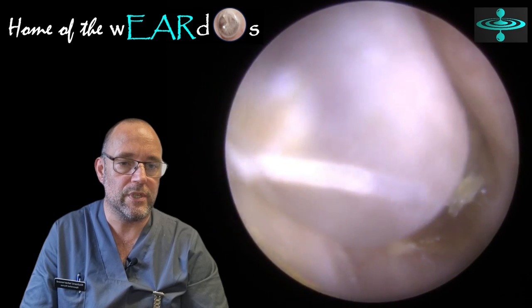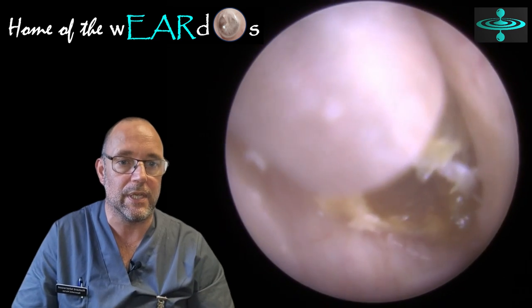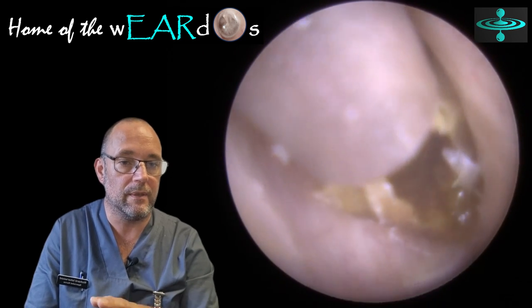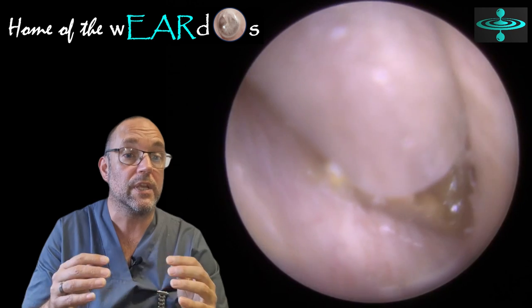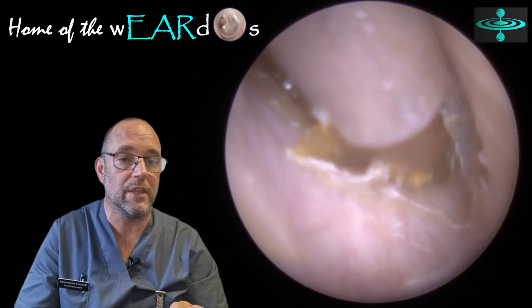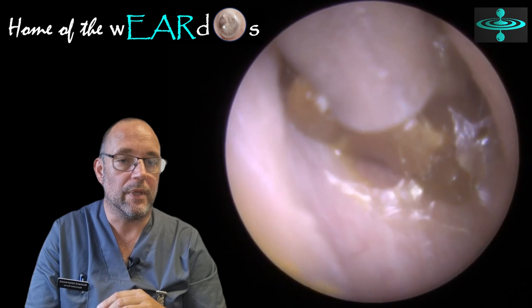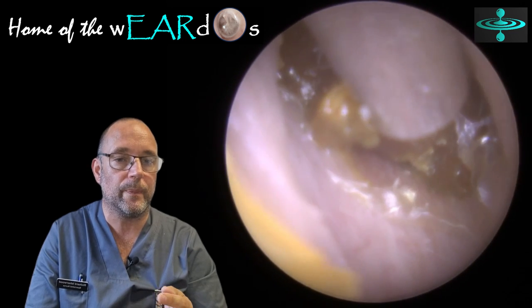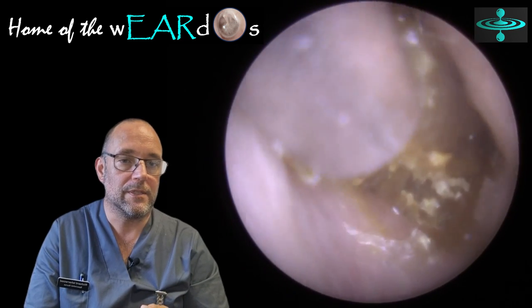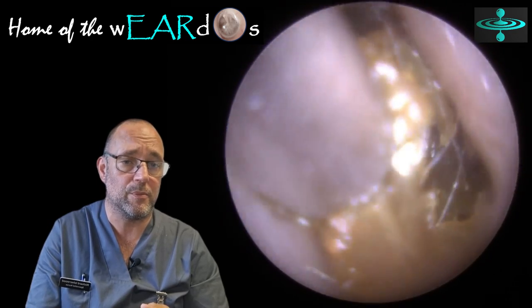You've got to be extremely careful. You've got to know just where you're putting it and roughly whereabouts you are in the ear canal. I think that bit at the bottom there might be the key to it — if I can grab that and fold it all together in a little parcel. Did you just see that come together then? I was hoping it would all come out with that, but it didn't. I keep getting a grip there, keep pulling back, but every time I do that there's resistance. So that tells us it's stuck a fair bit deeper down.